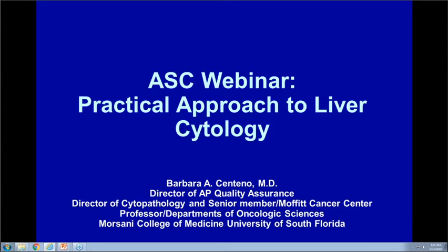Thank you. So as Dr. Güliz mentioned, my focus today is going to be on liver cytology.